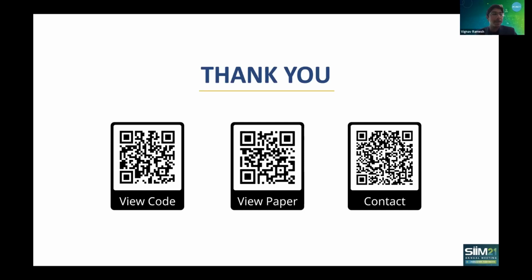Yeah, that's actually a great question, something we could definitely look more into. Right now, we didn't actually focus on that problem that much because the idea is to just use these extra sources of CTs as sort of a form of data augmentation for the actual X-ray models. And we found that regardless of the actual amount of consolidation on the CTs and whether that showed any sort of selection bias, still more annotations on the CTs would help the accuracy of the model in detecting those same kinds of annotations or similar annotations on actual X-rays in the test dataset. But that's definitely something we could look into further. It's a great suggestion. Excellent.